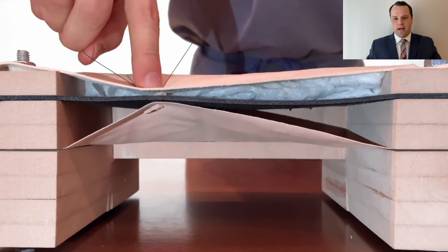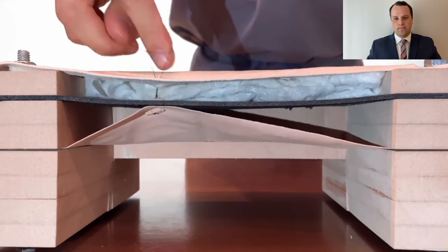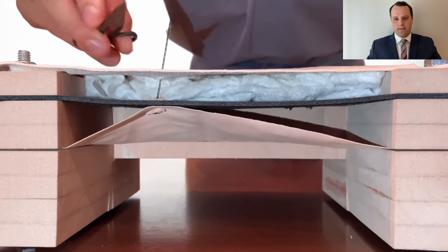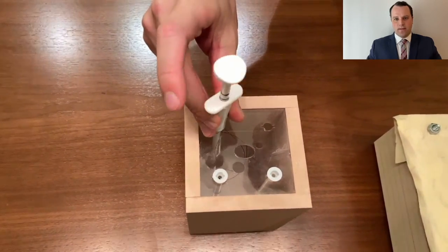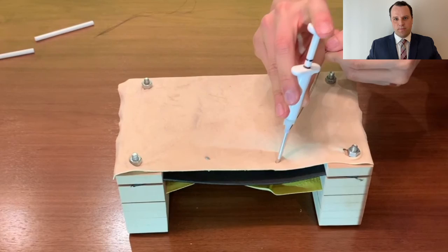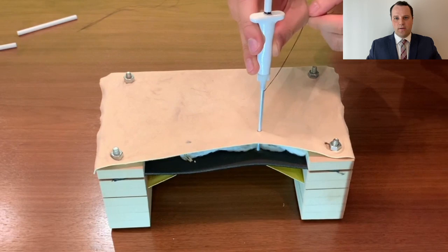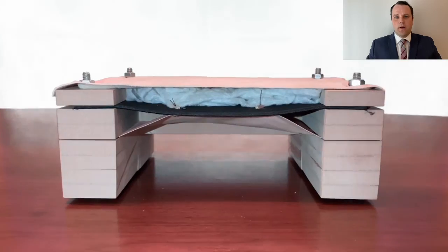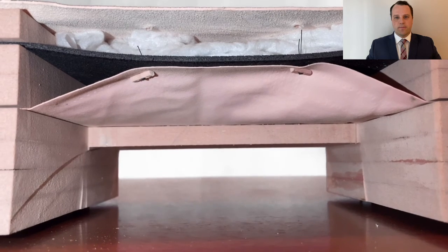The free suture ends are tied together and the knot buried to oppose the 2 tissues. The suture is cut at the skin, and the tails retract into the subcutaneous space. The second needle is loaded onto the same plunger. Here we can see deployment from the operator's point of view. We have found that angling the device helps to deploy the second anchor when the subcutaneous space is small. Cross-sectional view demonstrates a secure gastropexy ready for your gastrostomy tube.